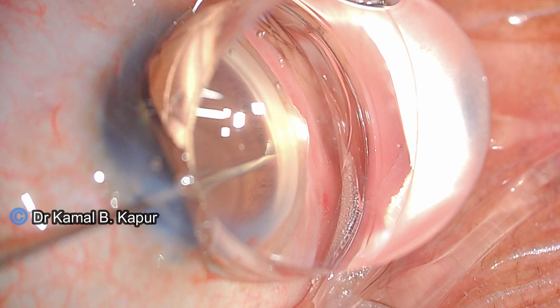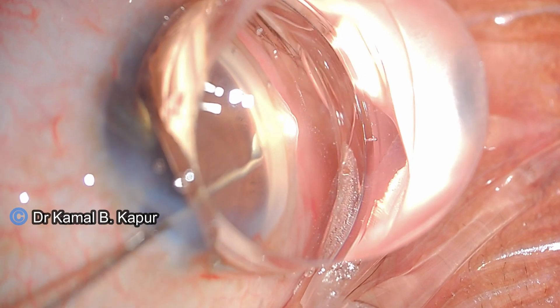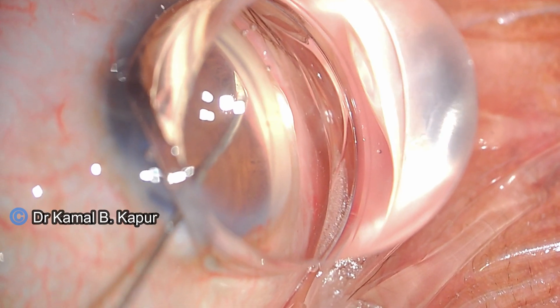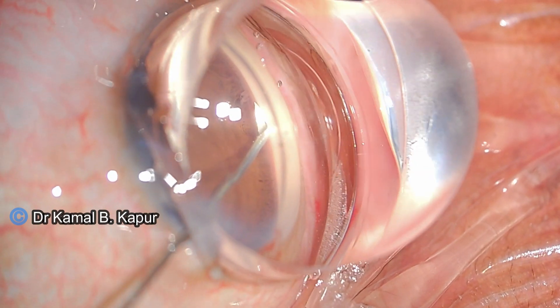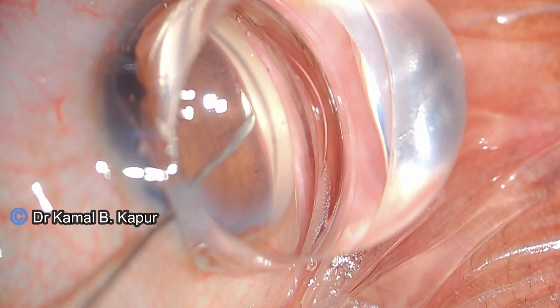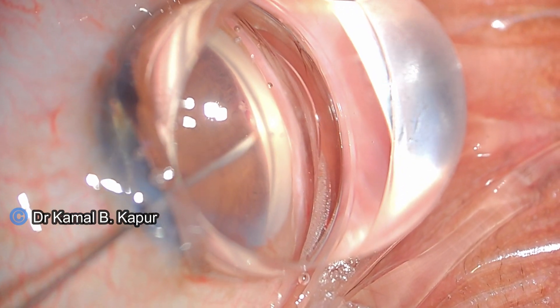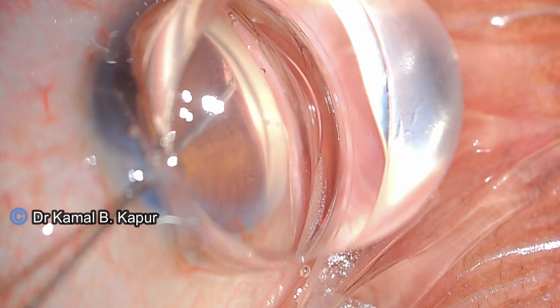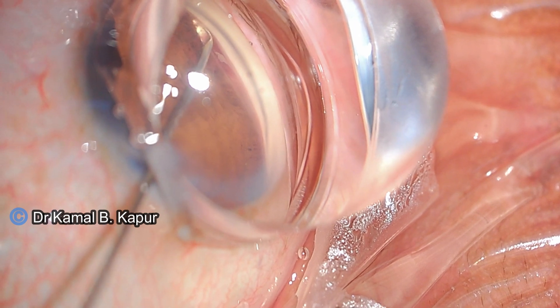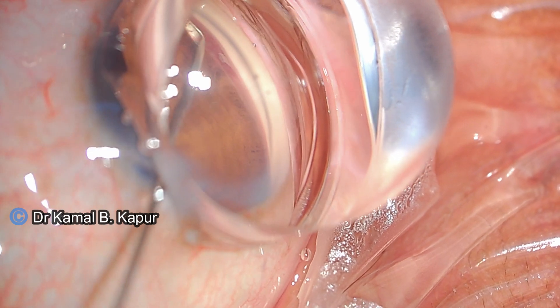If there is some ooze of blood during this step — which is expected — it actually means everything is going fine. If we are not able to visualize the structures properly, we may end up causing cyclodialysis in these patients, so proper visualization is very important. Here you will see me performing the goniectomy for approximately two clock hours or more, and at the end you will see some ooze of blood confirming that the trabecular meshwork is now open.